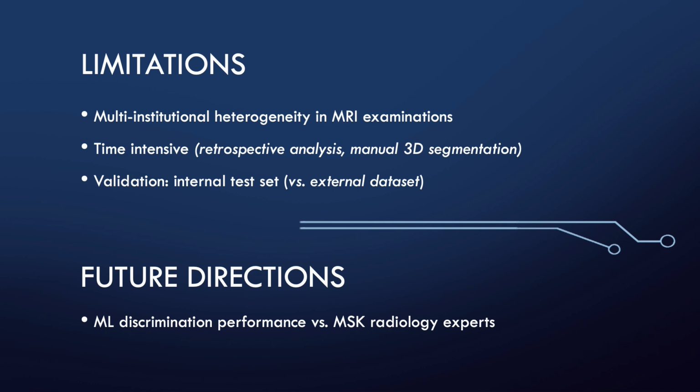Further opportunities in follow-up to the current study include external validation of findings with large multi-institutional datasets. In the future, a comparison of machine learning discrimination performance versus MSK radiology experts might offer additional insights and further support the translation of these models for use in routine clinical practice.